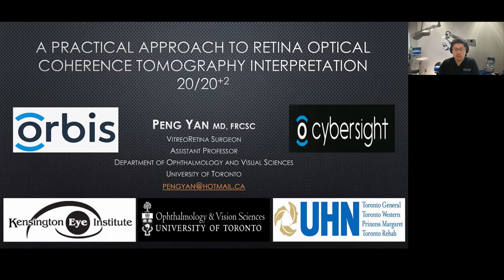I'm Dr. Peng, a Vitreoretinal surgeon and assistant professor here at University of Toronto. Thanks everyone for joining us, and hopefully I'll be able to share with you all a practical approach to the interpretation of macular OCT, which is something I do on a daily basis.